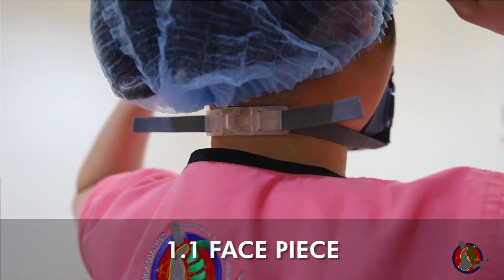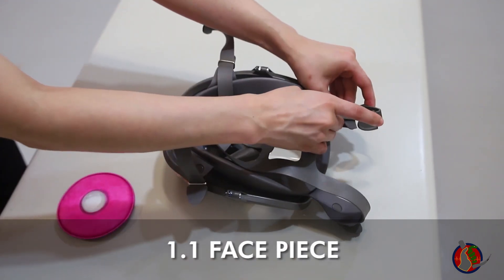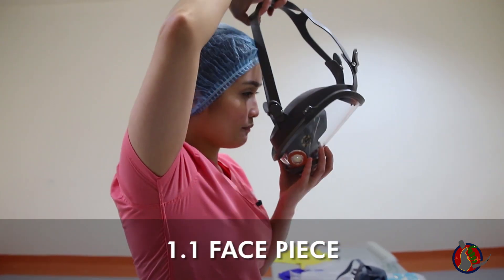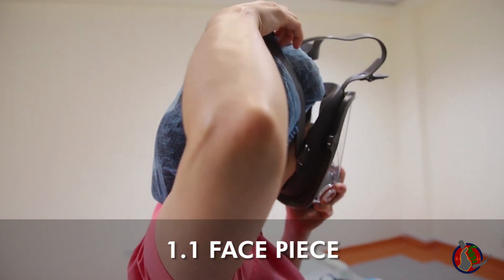For the full-face respirator, fully loosen all four head straps. Next, hold the front of the face piece with one hand and the straps away from the face piece with the other. Now pull the assembly down over your head and place your face through the opening.